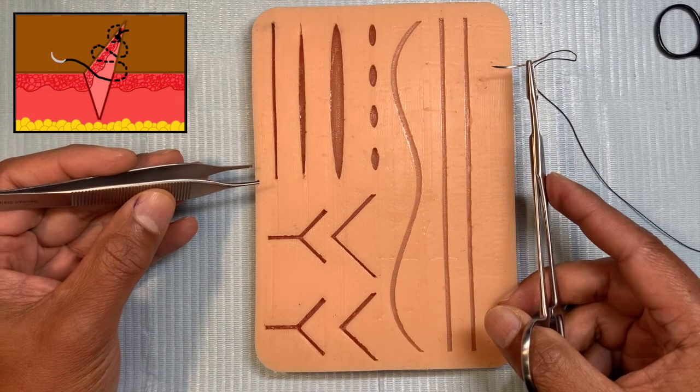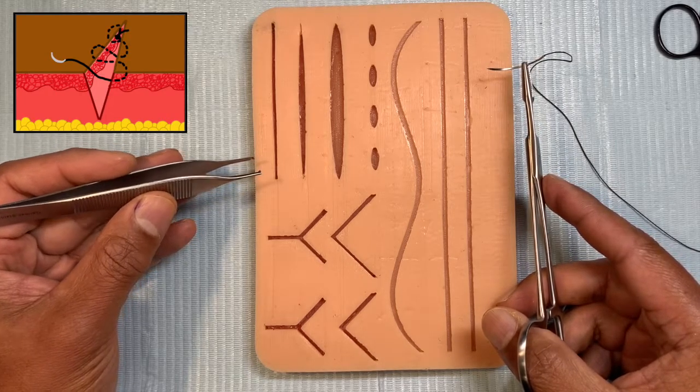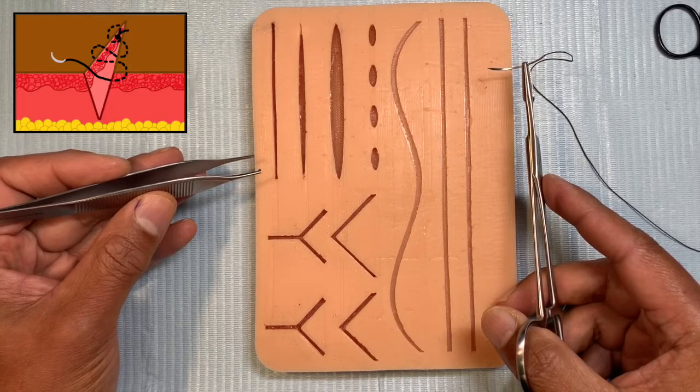This video is about the intracuticular suture. Some people also call it subcuticular, but correctly speaking it is running within the skin itself and not below it.